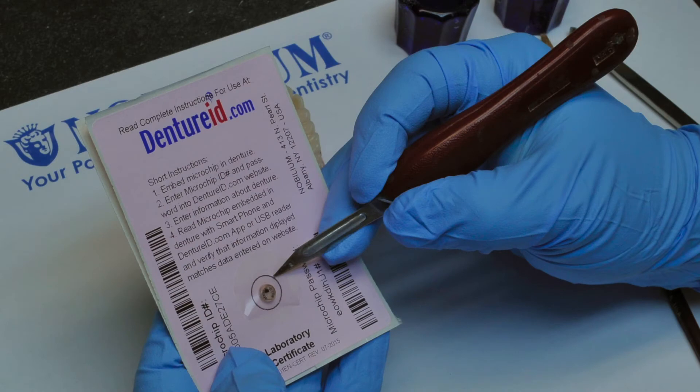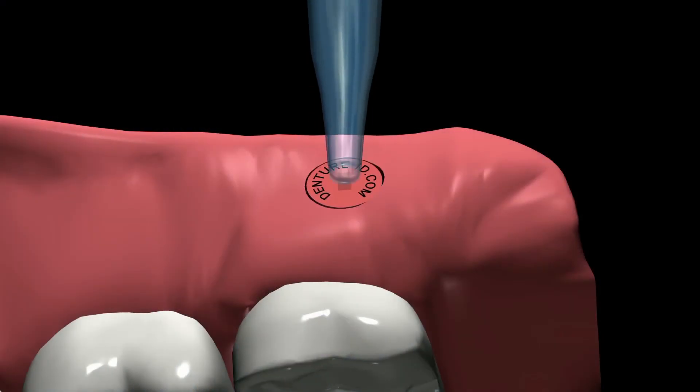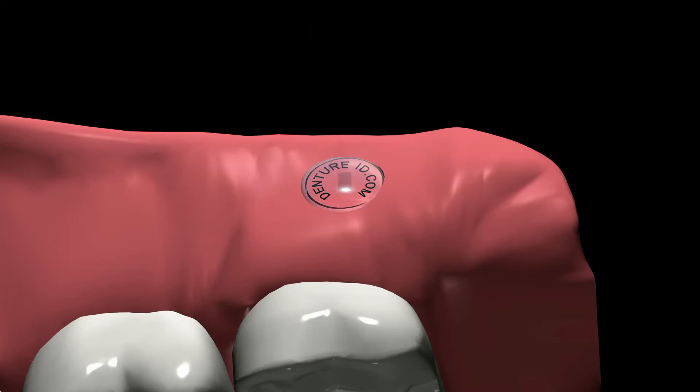Step 2: Remove DentureID.com microchip from certificate with a sharp blade and place it into the cavity. Step 3: Use a clear, self-cure orthodontic acrylic to completely cover the DentureID.com microchip with at least 1 mm of resin using the salt and pepper technique.